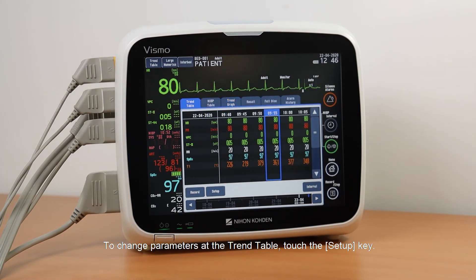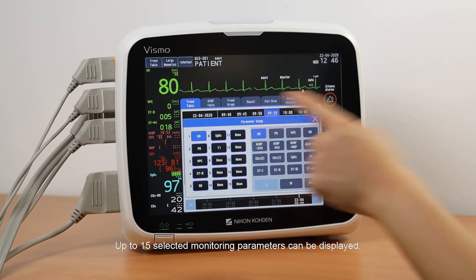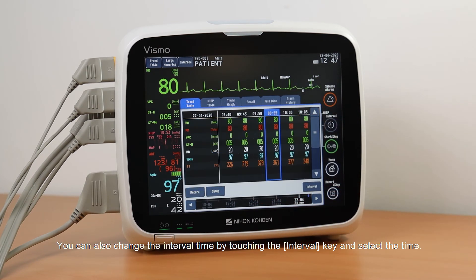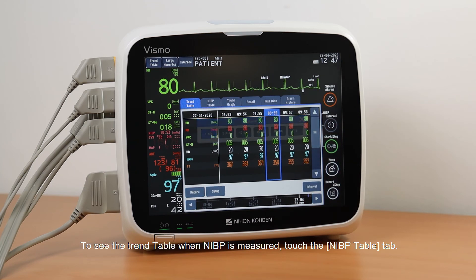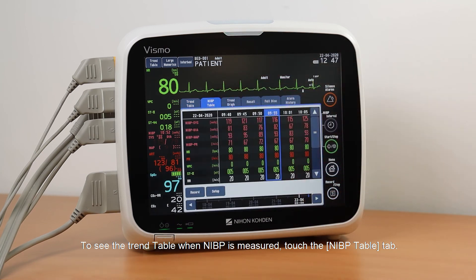To change parameters at the Trend Table, touch the Setup key. Up to 15 selected monitoring parameters can be displayed. You can also change the interval time by touching the Interval key and selecting the time. To see the Trend Table when NIBP is measured, touch the NIBP table tab.